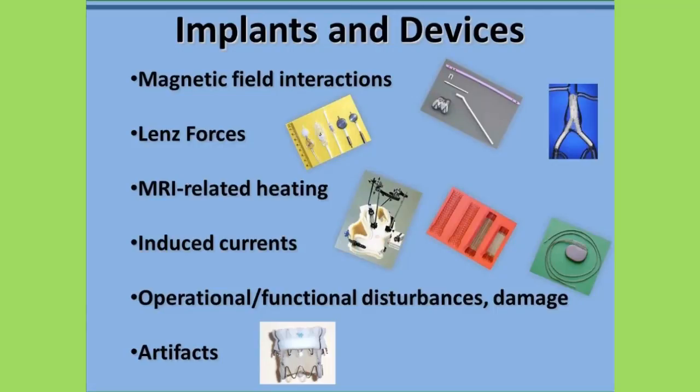Finally, artifacts may be present that can either compromise the diagnostic use of MRI, or the artifacts may be misinterpreted as an abnormality. Because implants are developed on an ongoing basis, it is necessary to obtain the most current information about these objects in order to ensure safety for patients and other individuals.